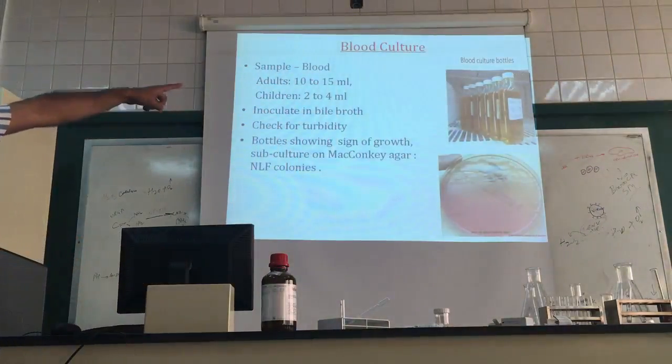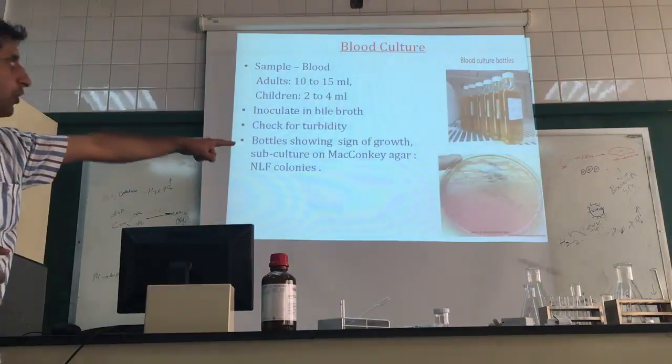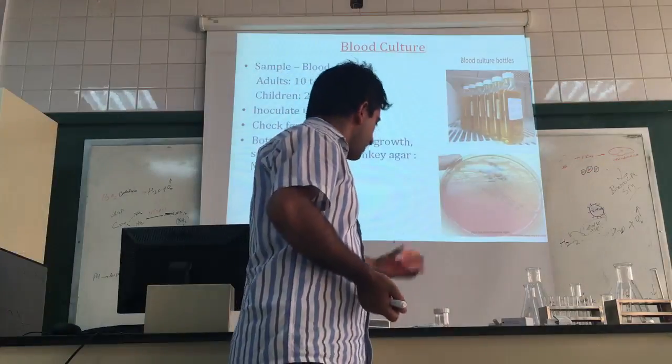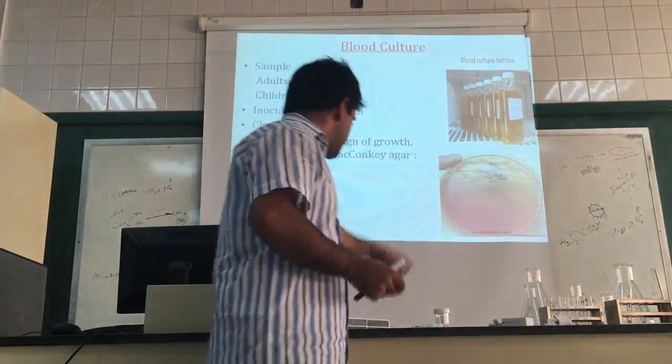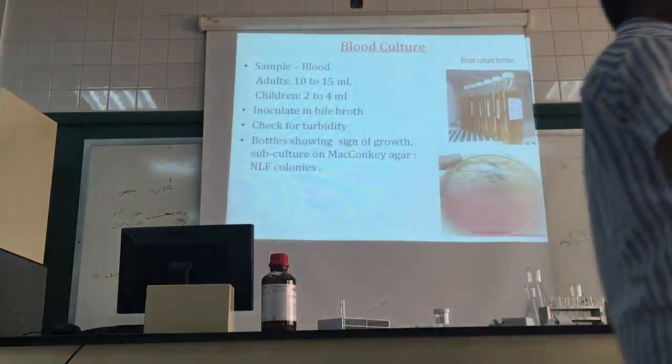So, after the culture, if we do the Salmonella culturing on the McConkey, you have heard about the McConkey culture? Yes. What features about the McConkey? Please tell us. Non-lactose fermenter. Correct. Lactose and non-lactose fermenter.